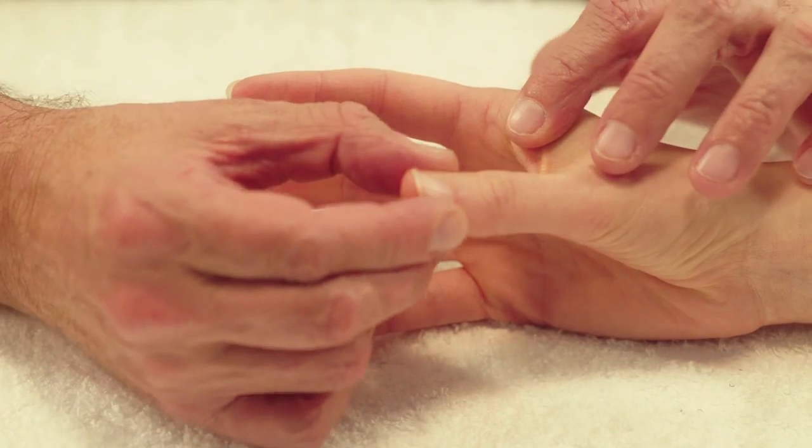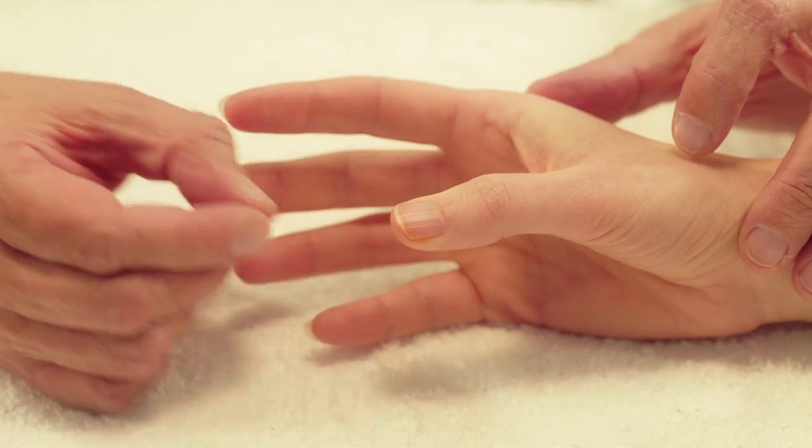Thus, this orthosis will not prevent adduction and or abduction of the thumb.